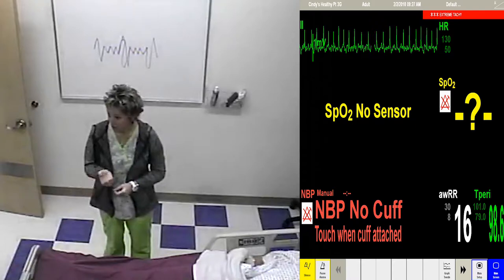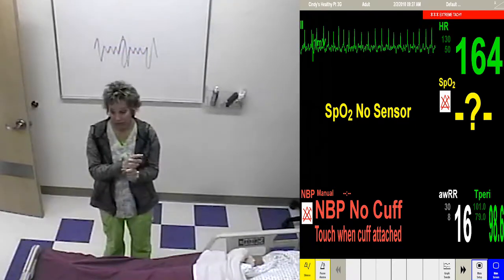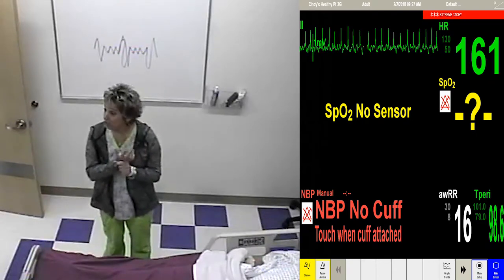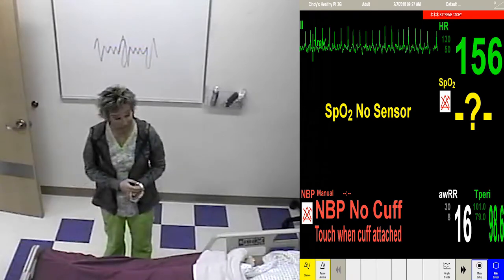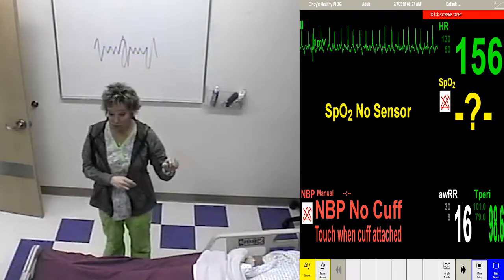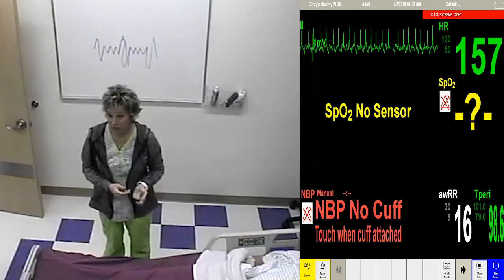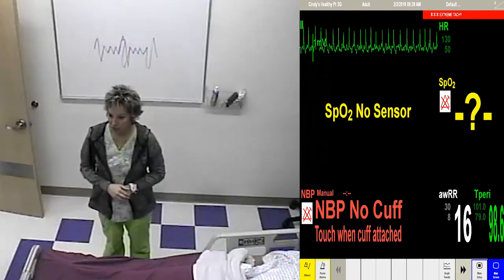Jell-O jiggling, right? So is this rhythm life sustaining? No. Very authoritatively stated, but incorrect. It is life-sustaining. People walk around in this all the time and don't even know that they have it. Now, we need to get it fixed, because what do you imagine signs and symptoms of your patient are going to be?